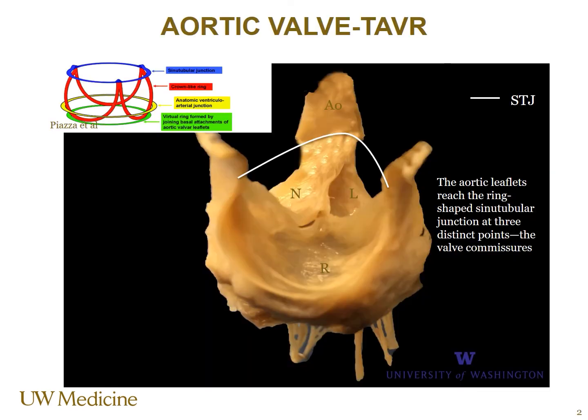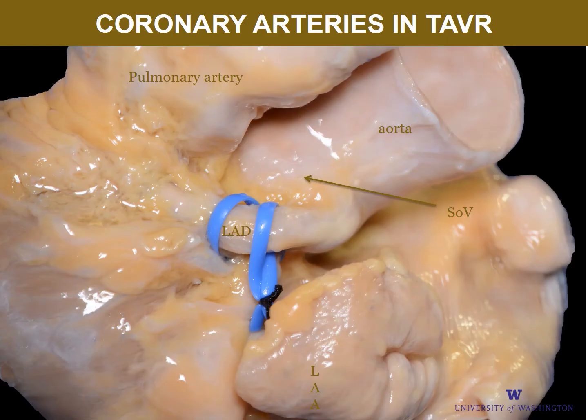We all know the general nature of the aortic root in the native form in terms of its commissures, the sinotubular junction, the annulus. But this anatomy changes dramatically once considering valve-in-valve therapies.